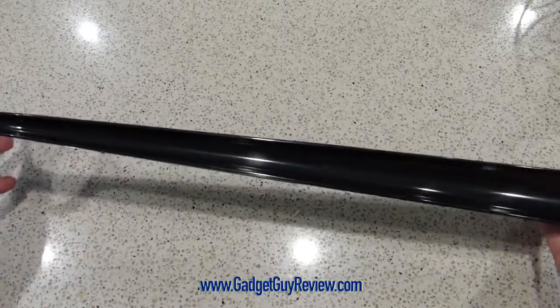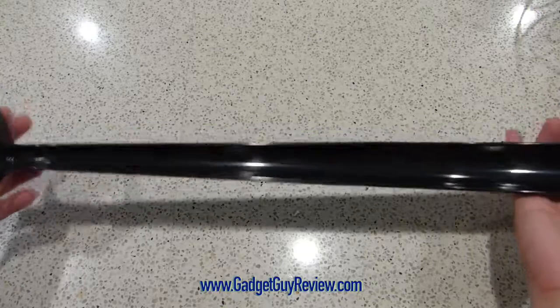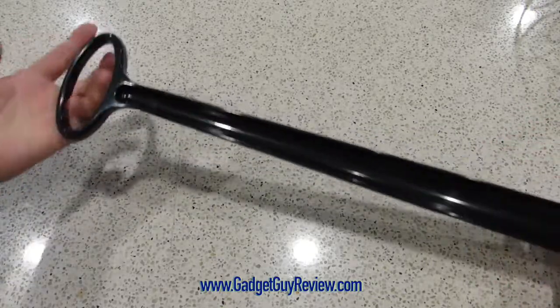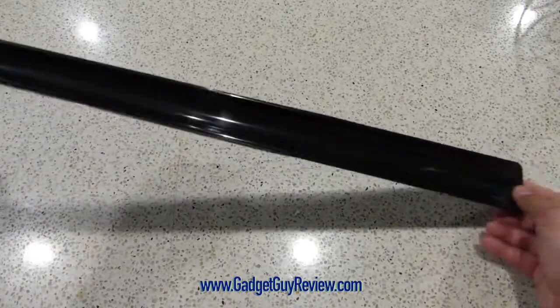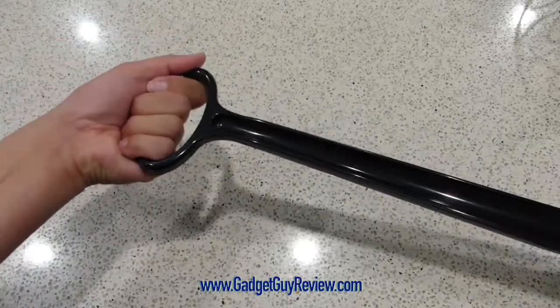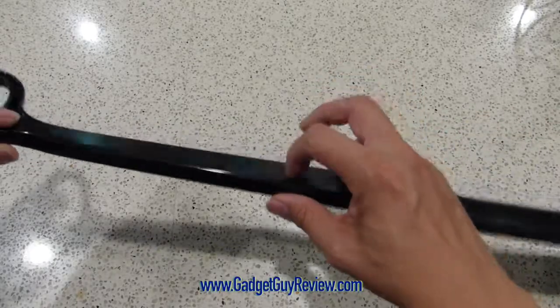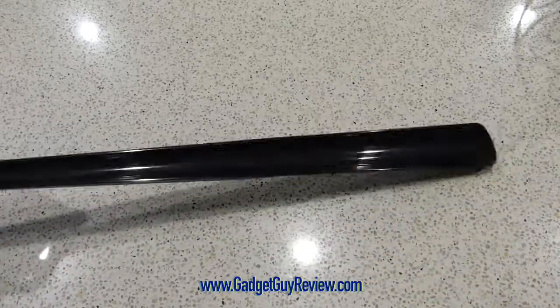Now this is a really handy shoe horn to have. It's 24 inches so for most heights it's going to be really convenient to just, without having to bend over, pull it down into your shoe. Now it also has this really nice big handle which you can wrap around your whole hand, and it is plastic but a pretty durable plastic — I can show you. Pretty strong.